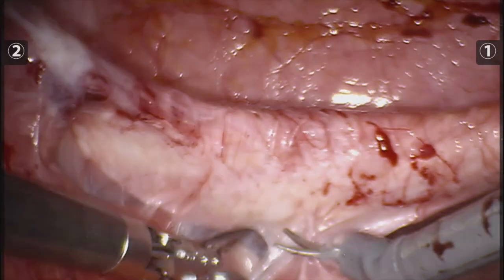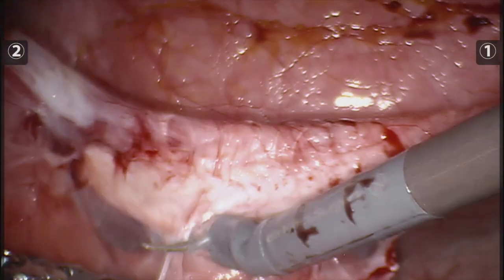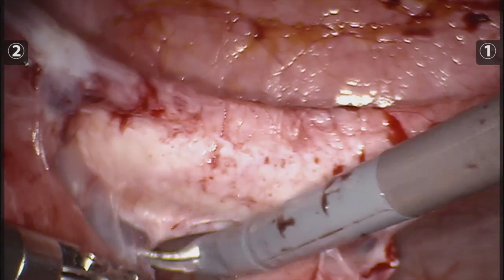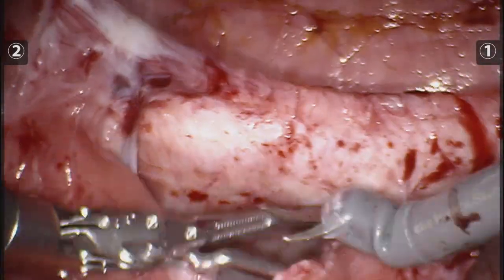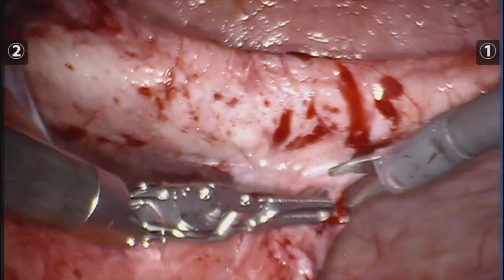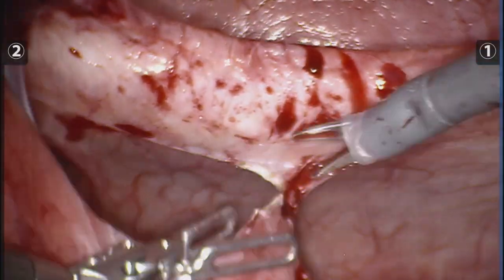Being this my second robotic case ever and my first robotic TAR, I had a wonderful proctor — Dr. Javier Curi and Dr. Francisco Galeana from Mexico City — come and direct me during the procedure.